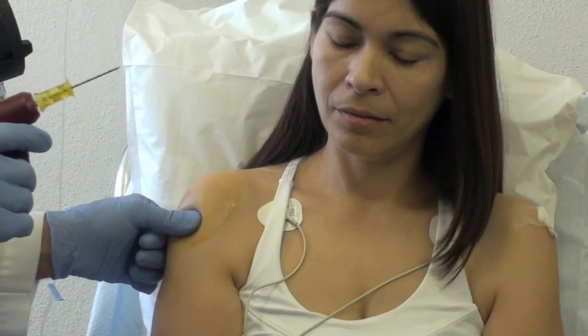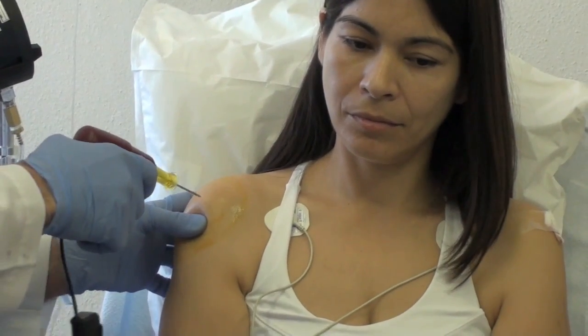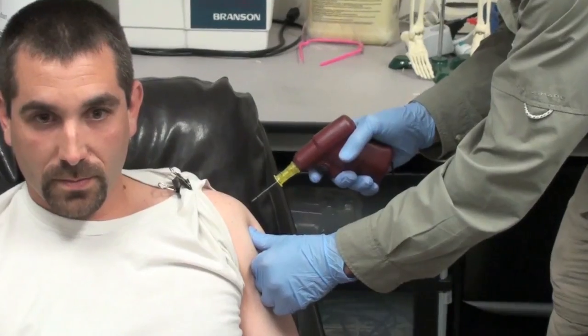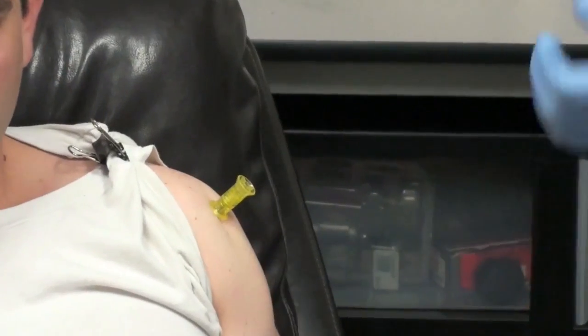There's our sight. The target is right above it. Here we go — one, two, three, and we're in. It's going to be a count of four. One, two, three, four. One, two, three. Just took three. Okay, we're going to go right in here. One, two, three.